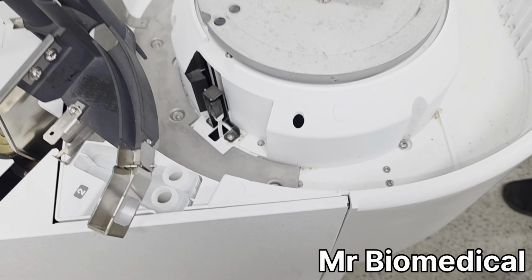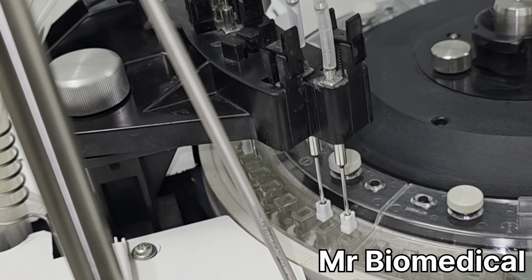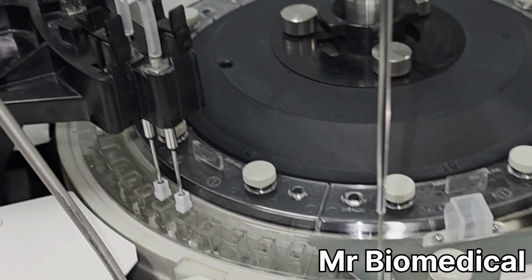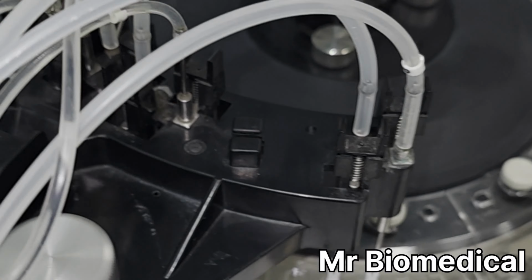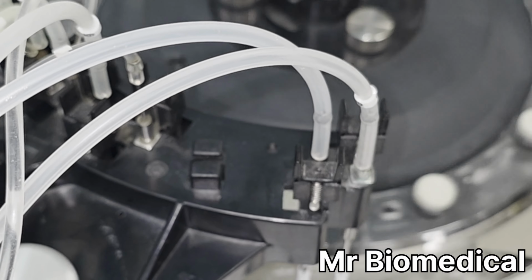Open here. Now you can see clearly the water is not splashing out, and make sure you are putting the new tube clearly. So now you can see there is no splash.